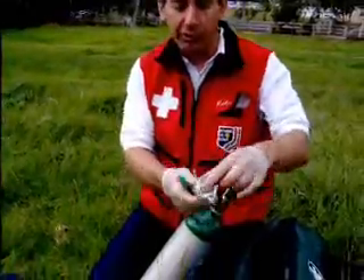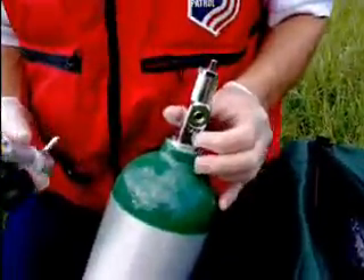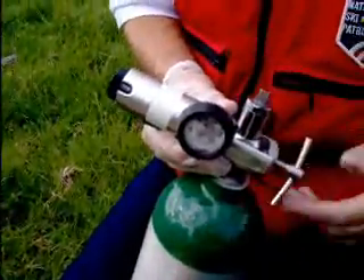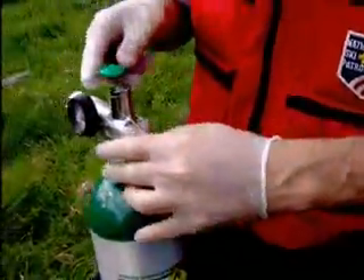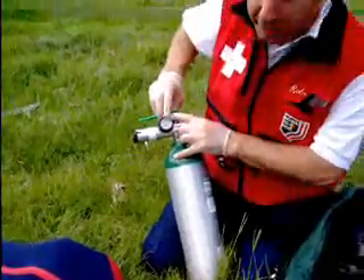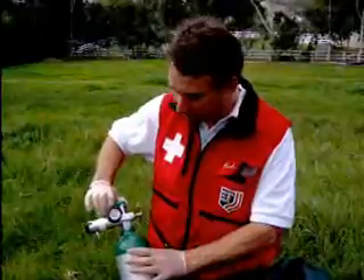To put it on, you'll notice that there are two pins here. They correspond with two pins on the opening. Simply put it in until it indexes in, tighten it up, set the flow off, and turn it on. You can now see the pressure. A full cylinder will be approximately 2000 PSI. Below 500 PSI, we don't use it anymore.